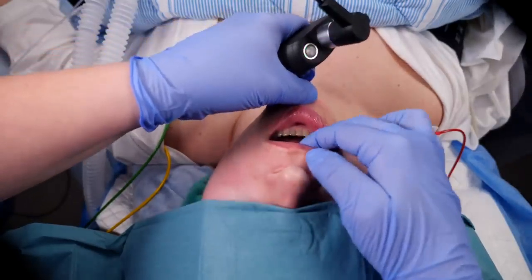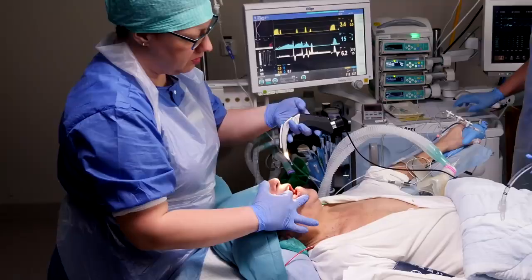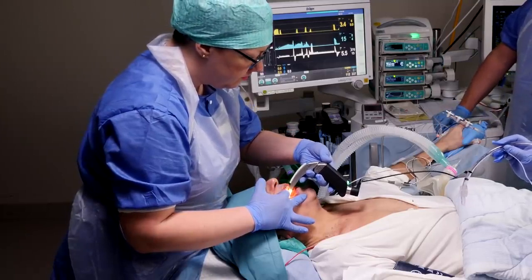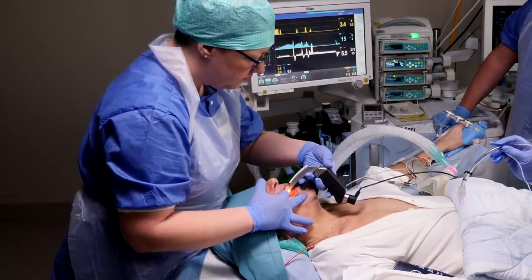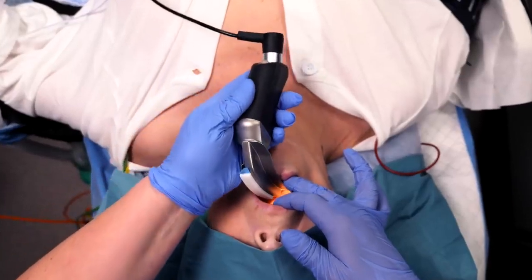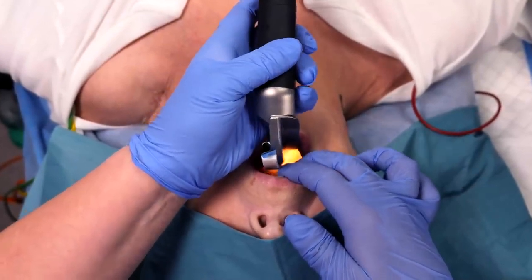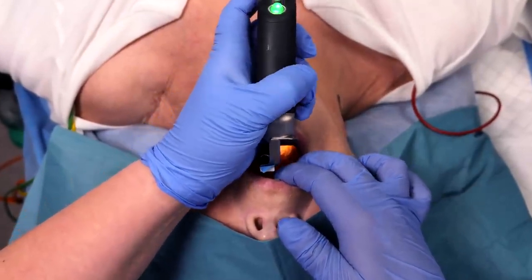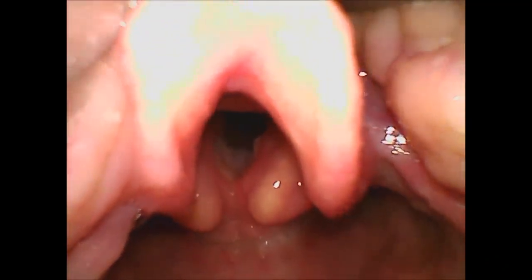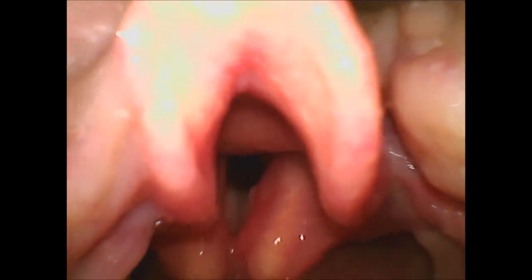Open the patient's mouth with your right hand and hold the laryngoscope in your left — not too tight — with three or four fingers as close to the blade as possible for precision and control. Insert the blade in the right side of the mouth, carefully pushing the tongue aside. The aim is to create an unobstructed line of sight to the larynx by pushing the tongue to the left and lifting the epiglottis, exposing the vocal cords. This requires precision, not brute force.